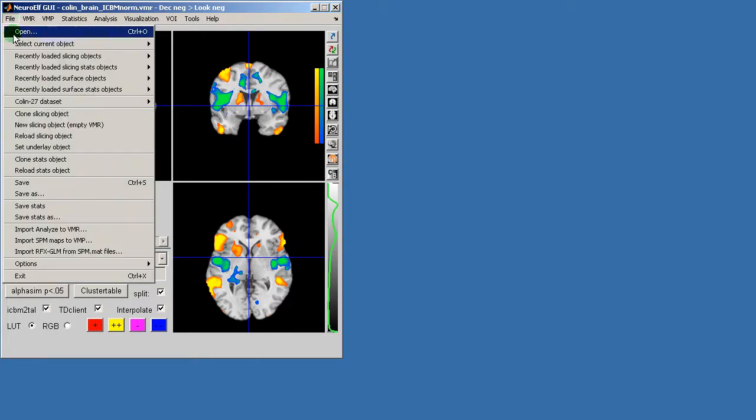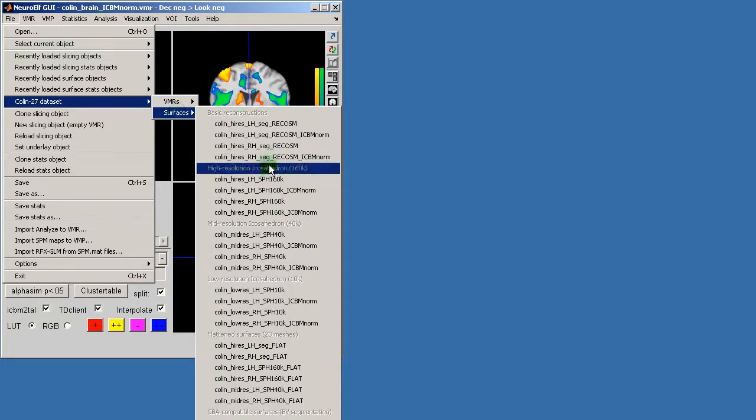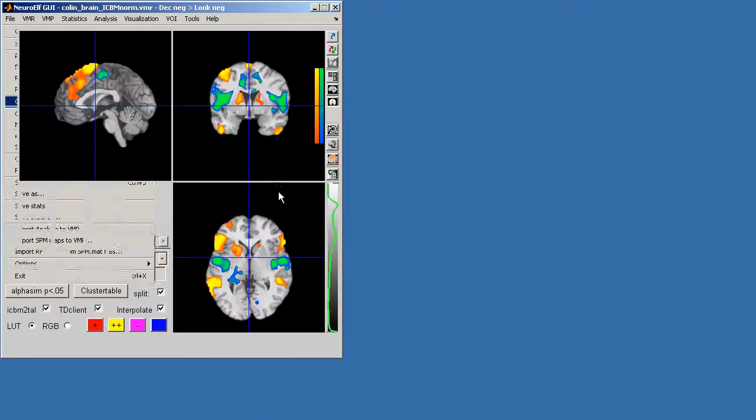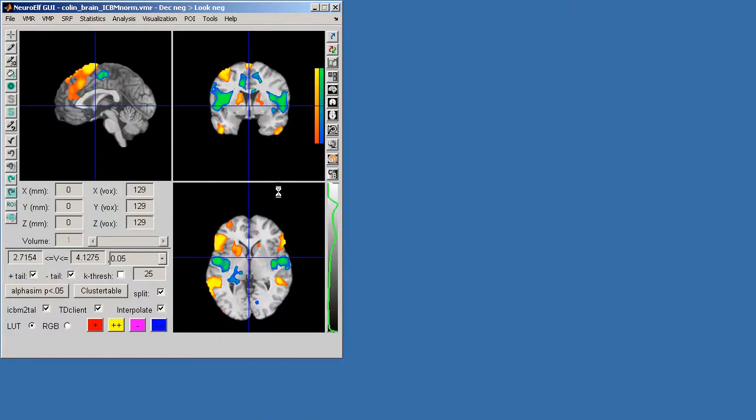So I'm going to the COLIN27 dataset surfaces and I'm loading a relatively high quality surface in this time.